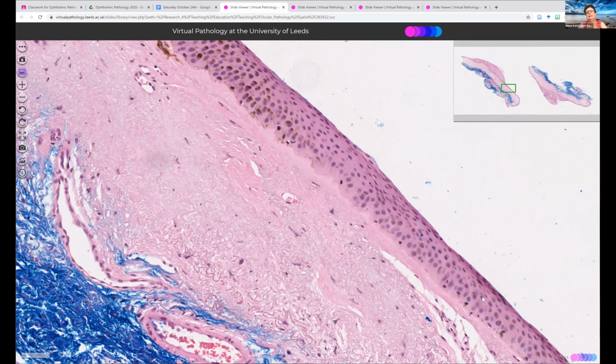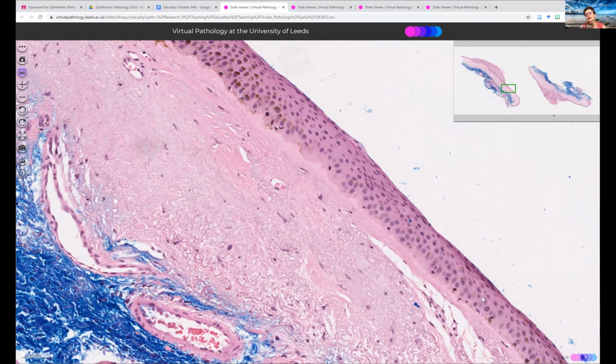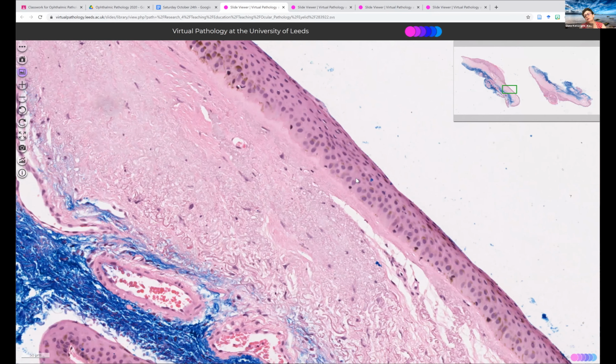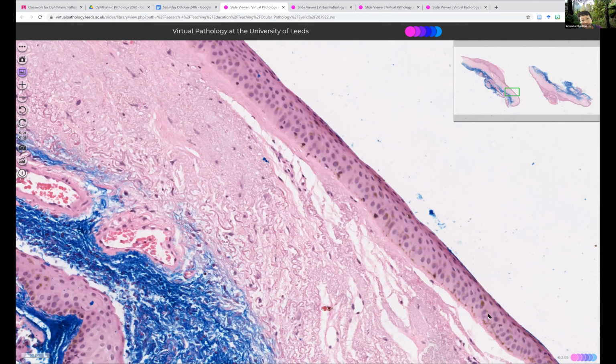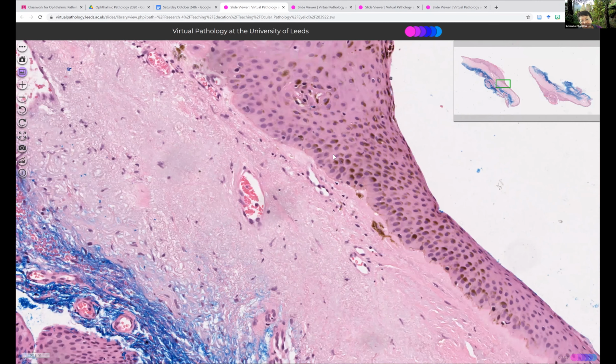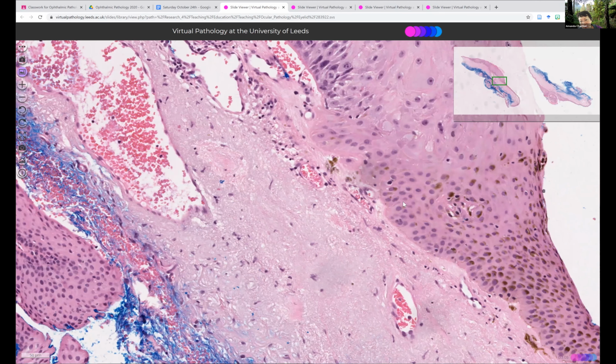This is why BCCs and seborrheic keratoses are pigmented. So I think this is physiologic pigmentation. And in the other places, you see it's down here, it's fallen into either a dendritic cell or probably melanin incontinence. As it's become disrupted, melanin has come out and it's in the subepithelial stroma.